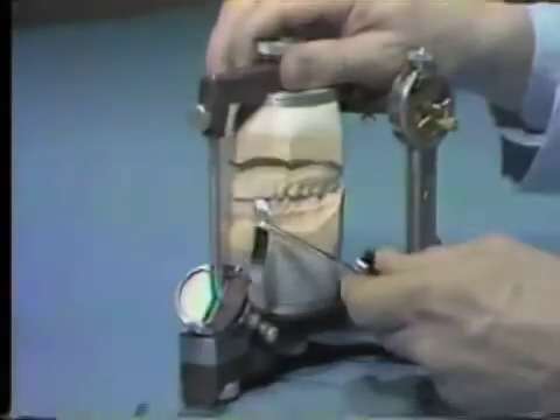The left cuspids will not contact in central occlusion since these teeth did not contact during the clinical examination.